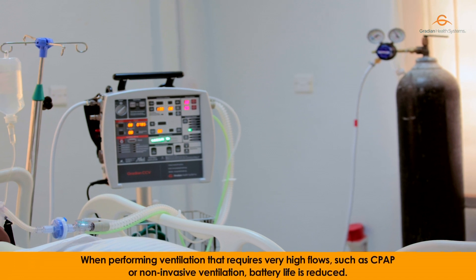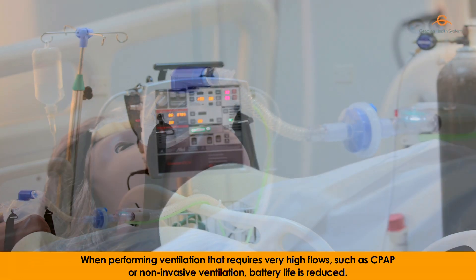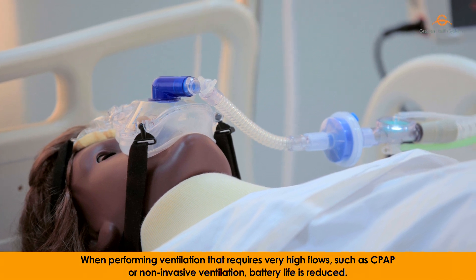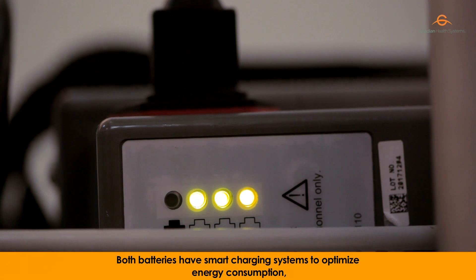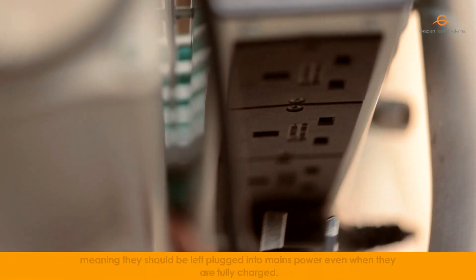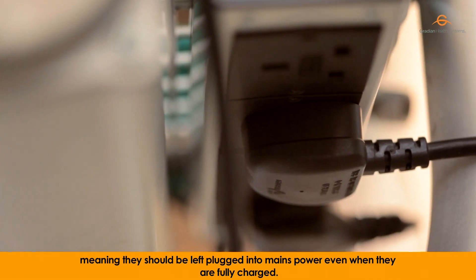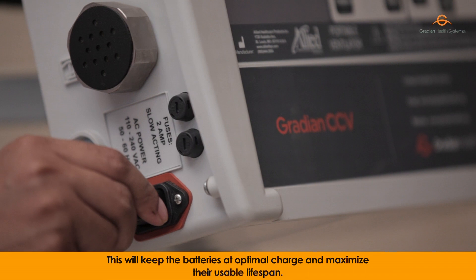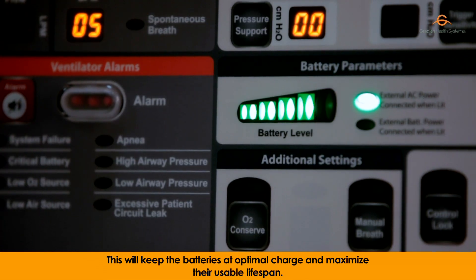When performing ventilation that requires very high flows, such as CPAP and non-invasive ventilation, battery life is reduced. Both batteries have smart charging systems to optimize energy consumption, meaning they should be left plugged into mains power even when they are fully charged.